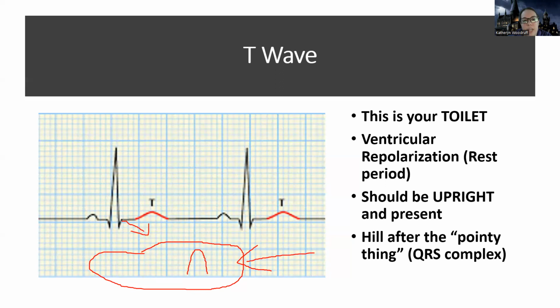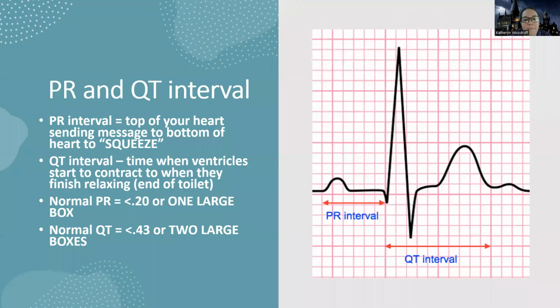So you definitely want to understand that it's the rest period. It can show signs of previous heart damage or current heart damage, like we have ST elevation in heart attacks and things like that. And just know it's that time where the toilet should not be flushed again, which will make sense when we talk about the next slide.